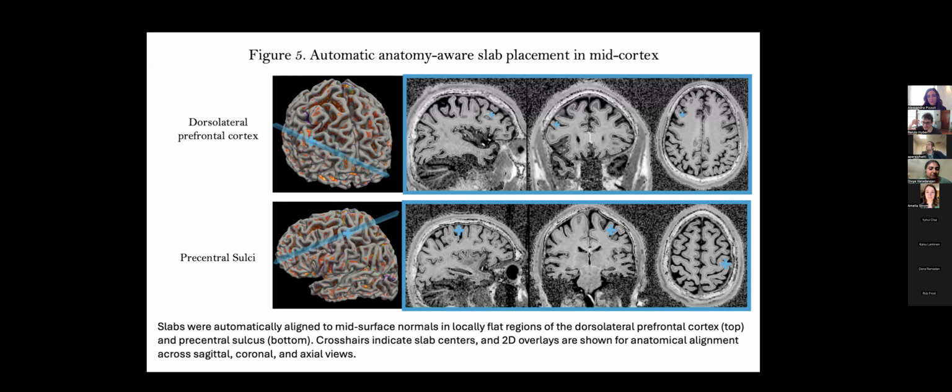So usually it is just two sulci in front of the central sulcus in the axial view, which matches approximately how it looks on the right axial slice as well. Yeah. And actually here we are also going to add, we did a GRE scan in this region. Right now it just shows where we place the slice, but Karthik's working on getting how that scan looks. It looks pretty good actually. So we're going to put that as well.